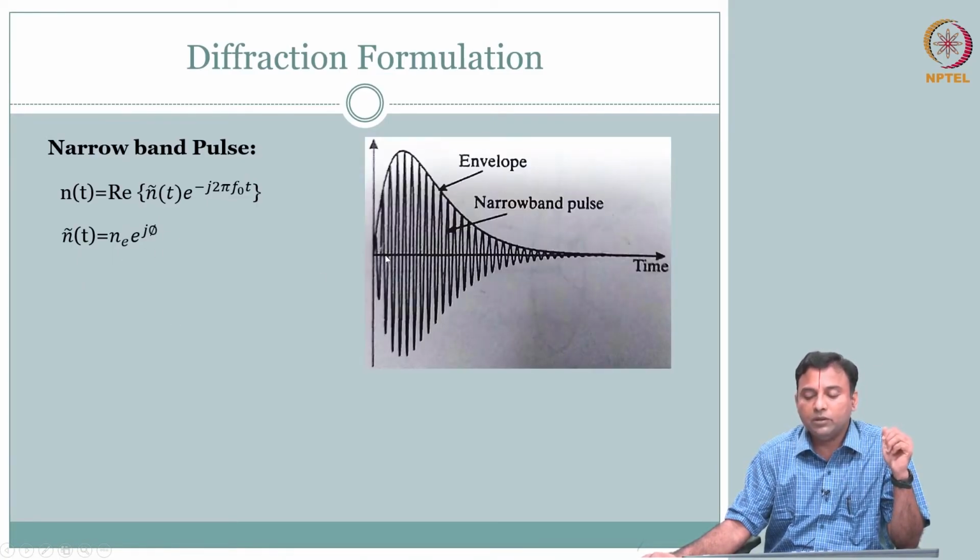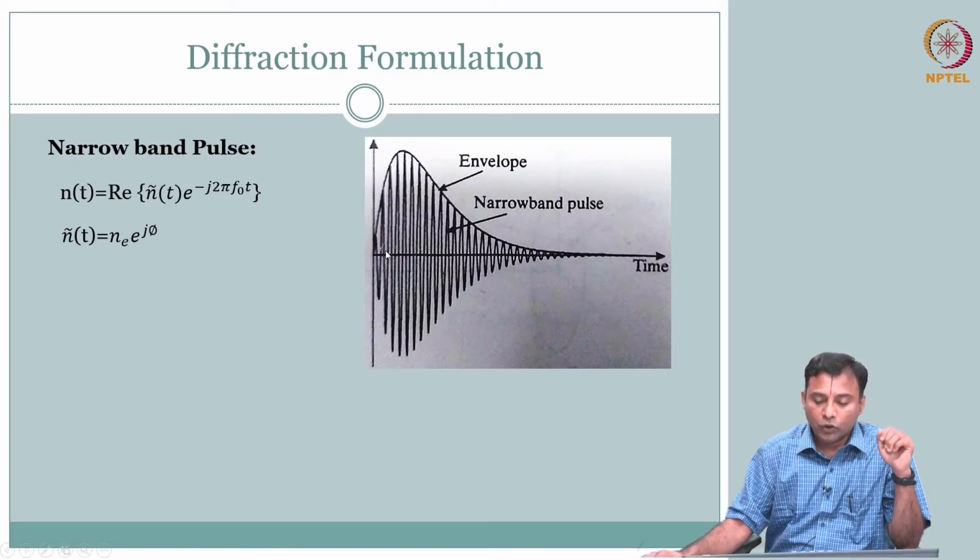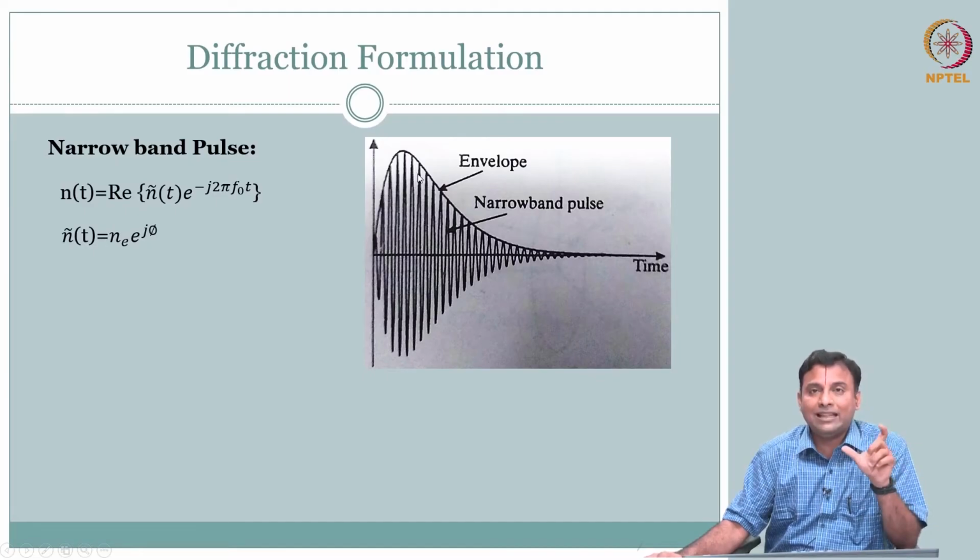So, essentially we are talking about a pulse echo. This is the pulse that you are going to send into the tissue. The crystal is going to oscillate in this fashion. You can look at it as a carrier frequency and then a modulation, whichever way you look at it. What you have is an RF signal with the center frequency related to your resonant frequency, and then there is this envelope. So, why is it narrow band? If this envelope, this pulse length, remember the pulse length I asked you to pay attention to when we did the axial resolution. So, we want this pulse length narrow band.